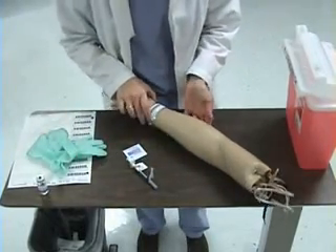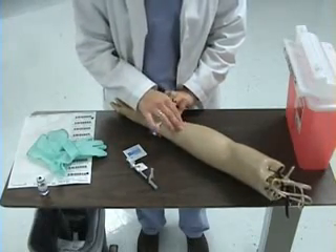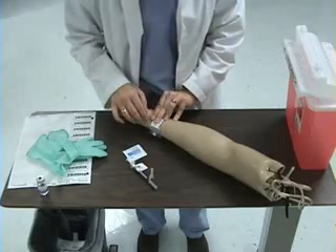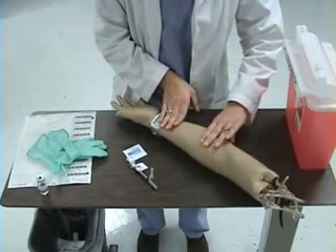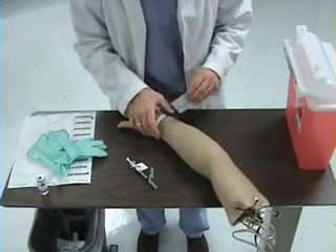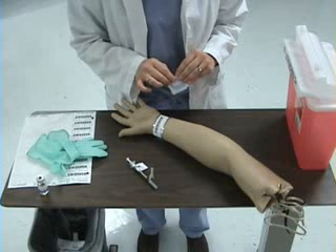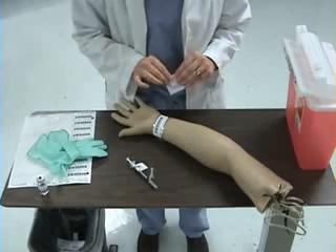At this point, I need to examine my patient's arm for any signs of redness, scarring, bruising, or scratches, as these are not adequate places to give an injection. The injection should be administered on the inner aspect of the forearm, in the middle third. It is also important to ask your patient if they've ever received a PPD injection and if they've had any reaction to it. If they have had a reaction to a PPD, they should not receive this injection.